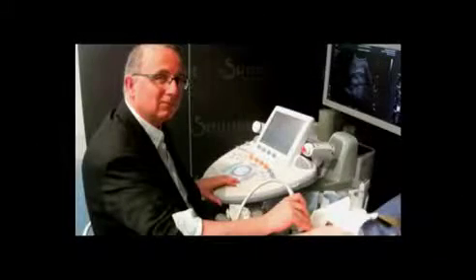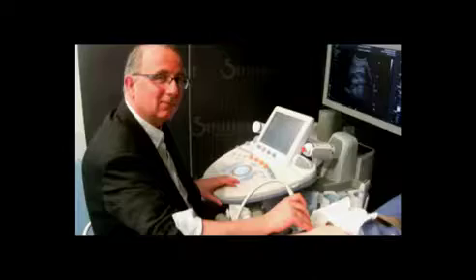On the ECR exhibit floor, Dr. Jean-Michel Correus of the Hospitalier Necker in Paris, France, demonstrated the capability of the Explorer in evaluating the liver of a healthy volunteer.